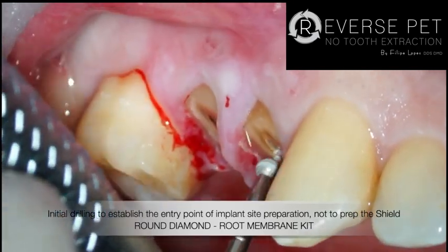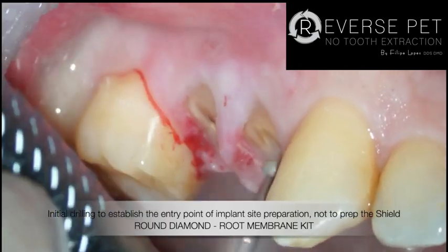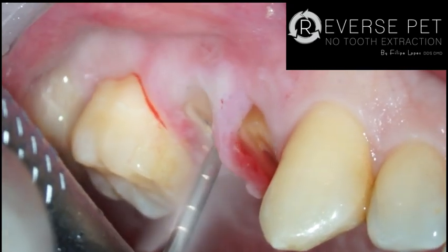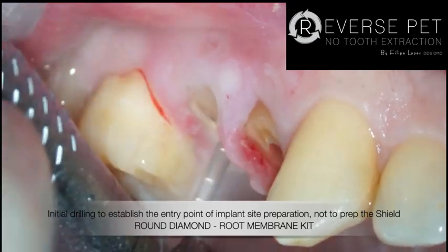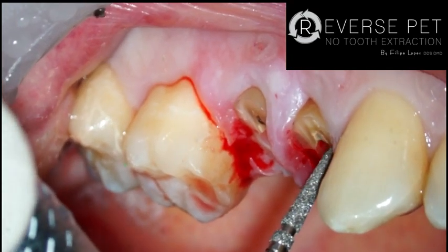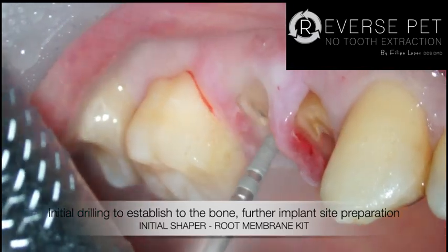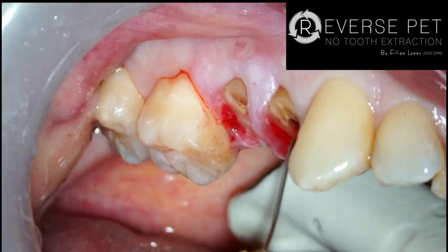So the first thing is to establish the entry point of implant site preparation, okay? Not to prep the shield as you do in conventional partial extraction therapy. What I'm doing here is establishing the direction of my implant site prep, and I'm doing it with a round diamond from the root membrane kit. And I'm doing it further. Now I'm advancing not only in tooth, but also I'm doing the initial drilling and reaching bone.